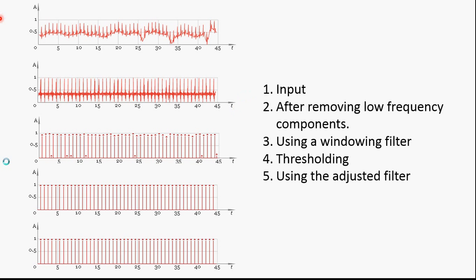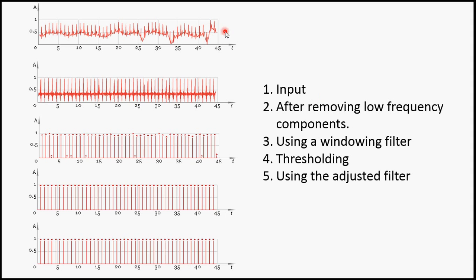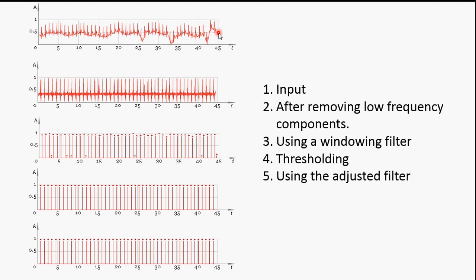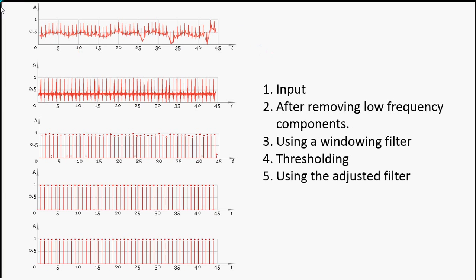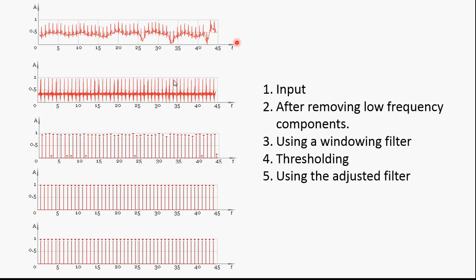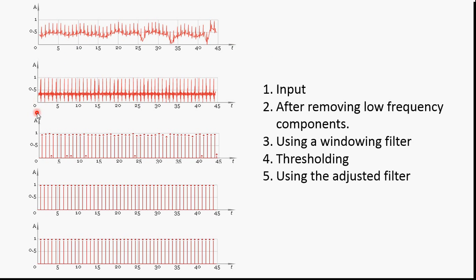So this is the output for a sample signal. Step 1, this is the input. And then next step, after removing the lower frequency components, the signal looks like this.